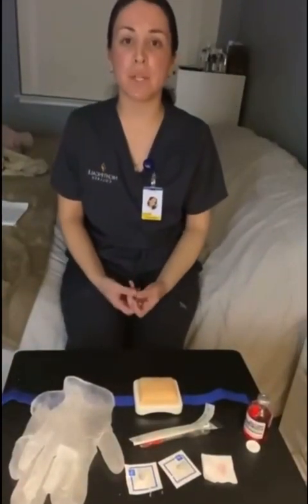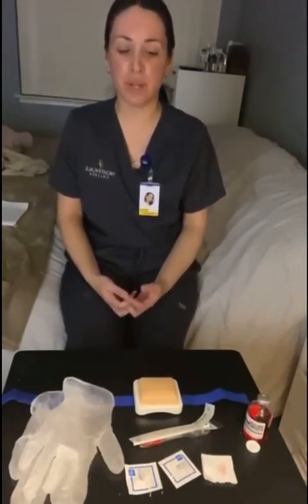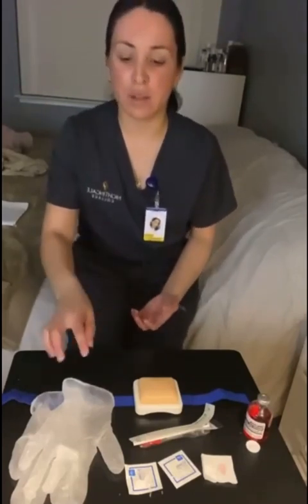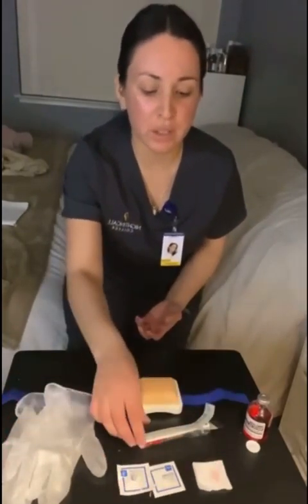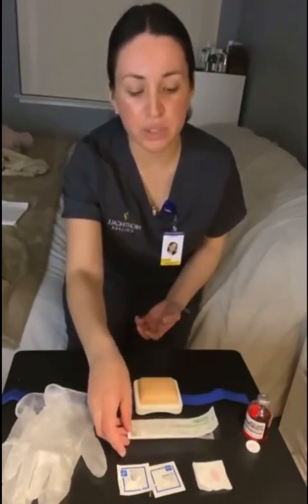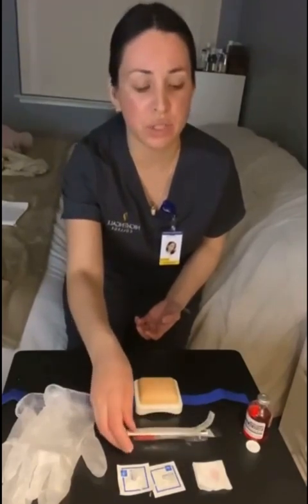My name is Kayla. I'm going to perform administration of intradermal injection skills video today. So I'm going to verify the healthcare provider's order. I'm going to gather my supplies. I have gloves, alcohol swabs, gauze, a bandage if needed, the 29 or 30 gauge 1/2 inch needle with the 1 milliliter syringe. In this case, we already have the needle permanently attached to the syringe.